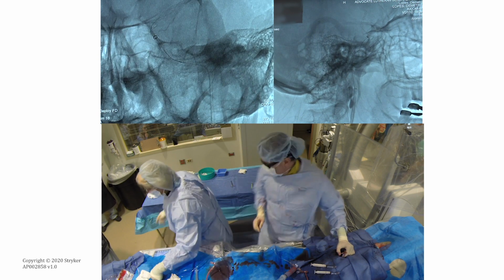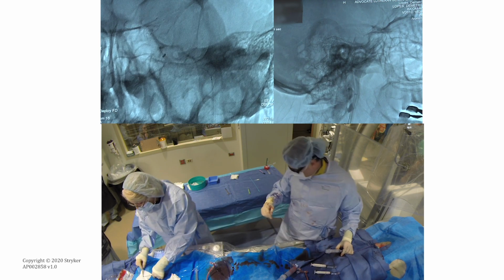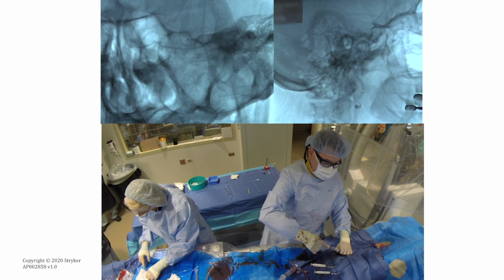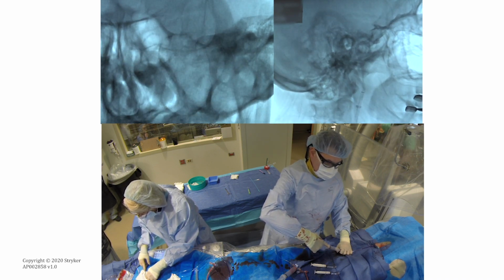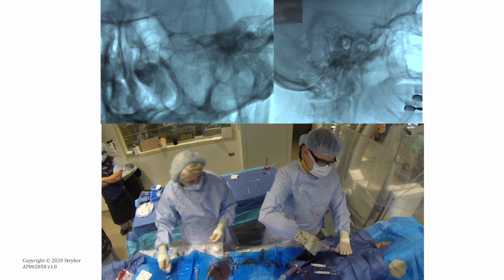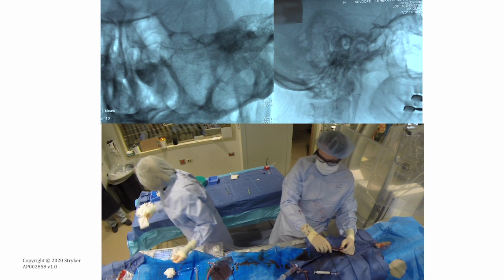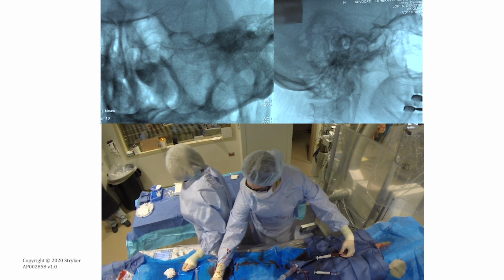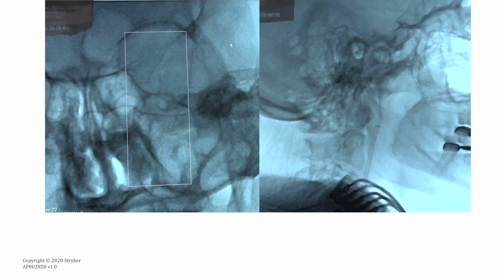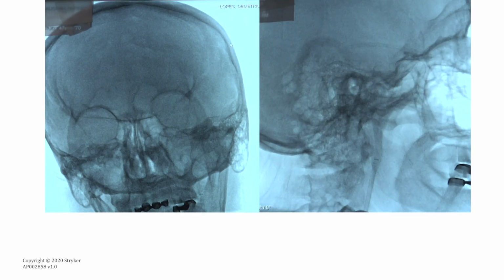So now we let back bleeding from the balloon guide, and I'm going to gently allow the flow to the balloon guide to come down, so the balloon is deflated, and you see how fast that was done. Since it's half and half contrast and saline, with one aspiration you're able to deflate the balloon. And now we're ready. You see that I do one more aspiration to make sure that no clots are in the balloon guide, and then we're going to position ourselves now for the run to confirm the results of the mechanical thrombectomy.